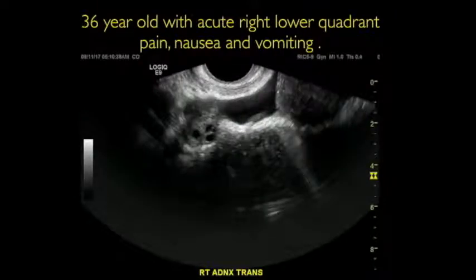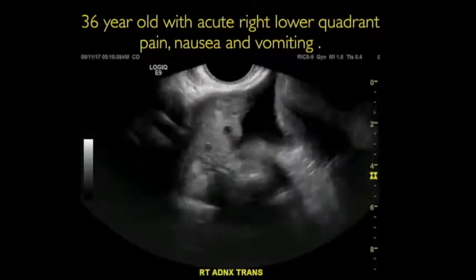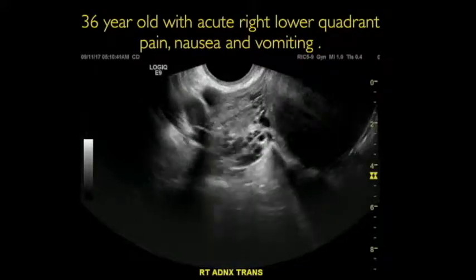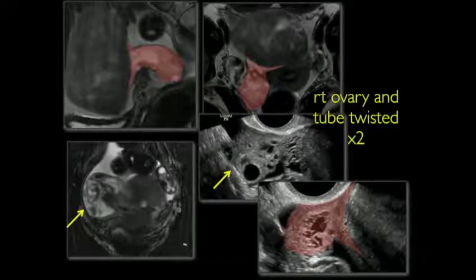Here's another patient, 36-year-old, with acute right lower quadrant pain, and nausea and vomiting. On the cine, it was really hard to find the ovary, and there was free fluid. And you say, well, it kind of looks like a twisted vascular pedicle, and there's a huge mass. Is the mass coming from the uterus or adnexa? In this case, we figured we're dealing with torsion. Could it possibly be a necrotic fibroid? Then we moved on to the MRI, and that beautifully shows you that there's a claw sign from the edematous tube and the ovary, and this was a torsed fibroma, which led to this process here.